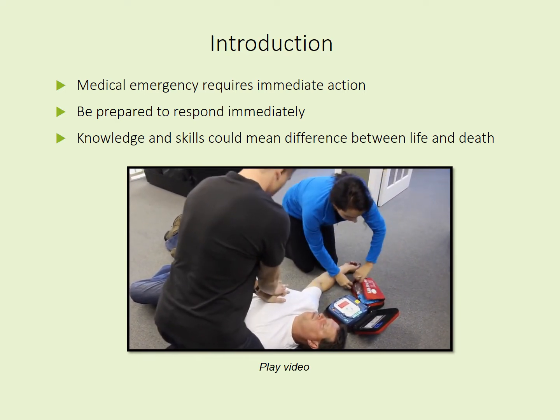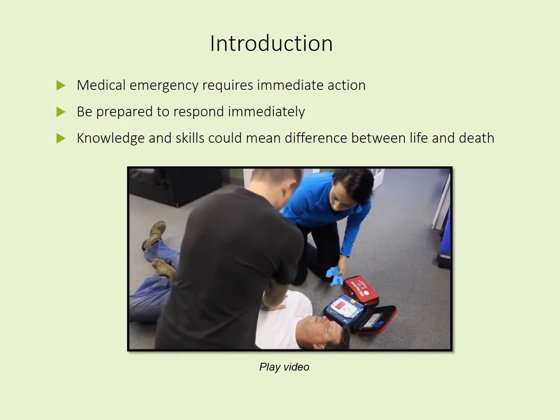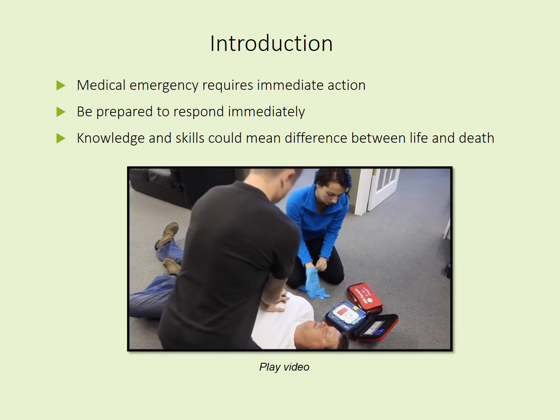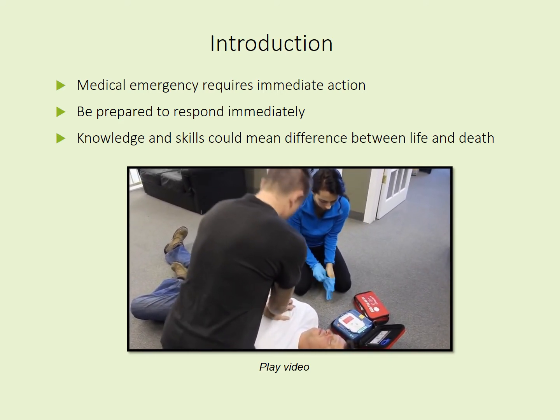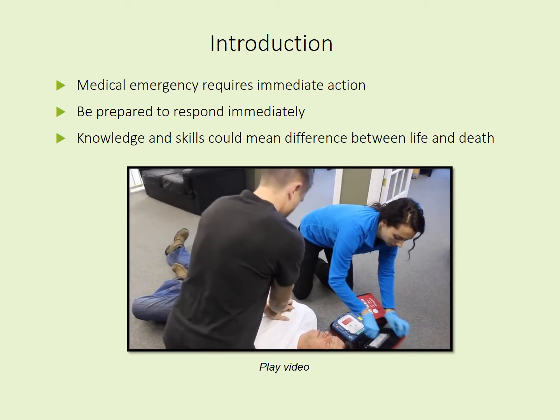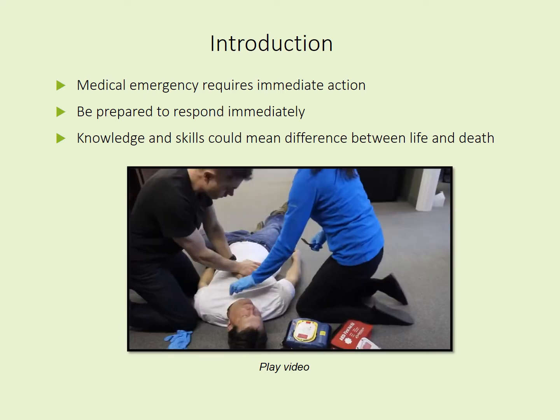Begin by removing all clothing from the patient's chest. Cut clothing if needed. When patient's chest is bare, remove protective cover and take out white adhesive pads.